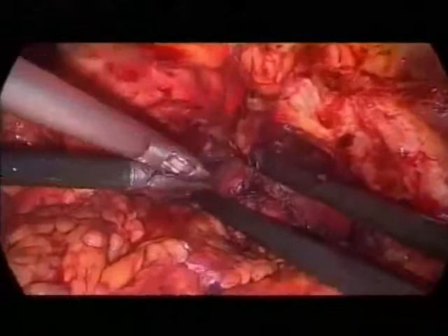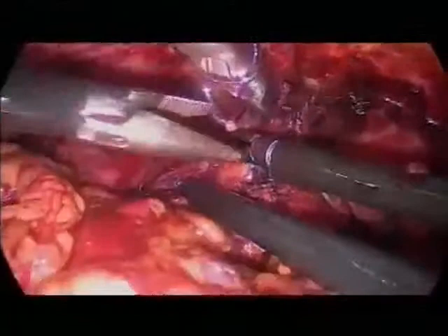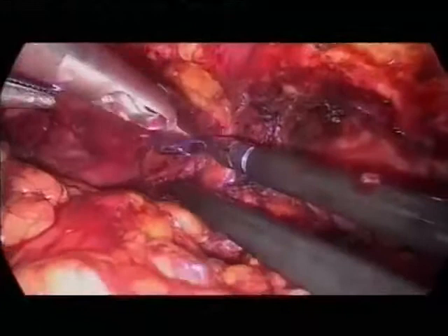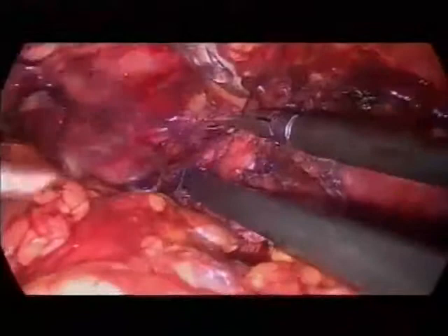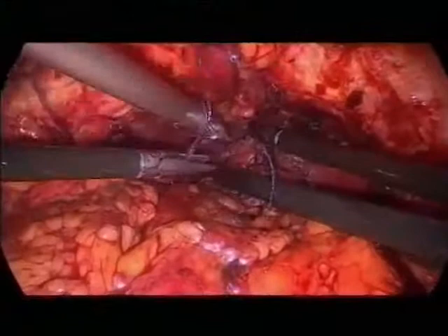I think there are many ways to Rome. We know that. I'm feeling safe. That's probably the most important reason to do this stitch. But as I said before, you have shown it, and Richard has shown it many times, that there's no need to do it. But I would say it's more for experienced surgeons. I would not recommend this for beginners because you can have bleedings even if you drop the pressure down to 20. So, I know that you're doing it.